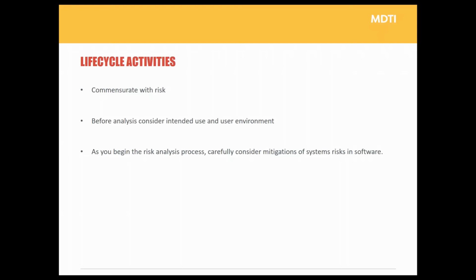As you begin to risk analyze the process, especially for those devices where software is a controlling element of a bigger medical device, be cautious about mitigating system risks in software, using software as a control and risk mitigation tool, if only because if that isn't controlled in a very, very careful manner, those controls can sometimes lead to unintended consequences by limitations of service or other unintended effects that knock on to the overall safety and performance of the device. So just mitigating everything in software isn't always the answer, is what I'm saying here.